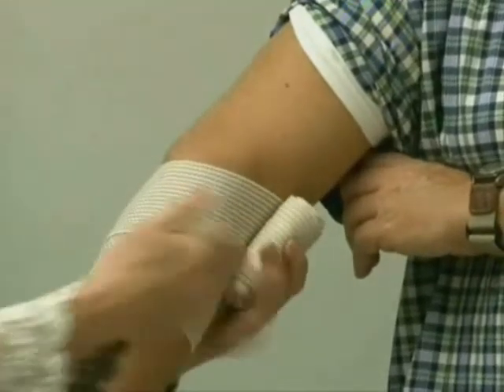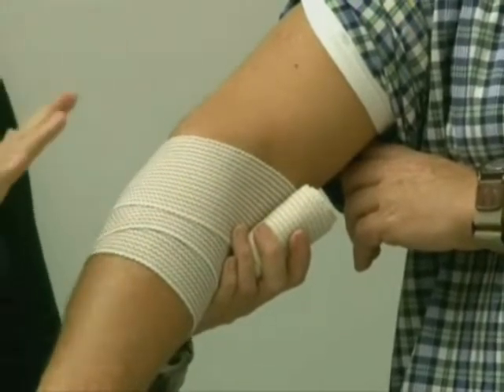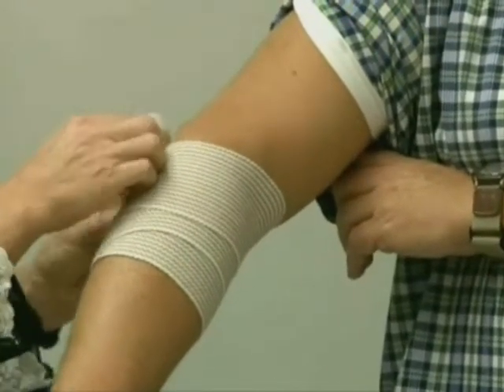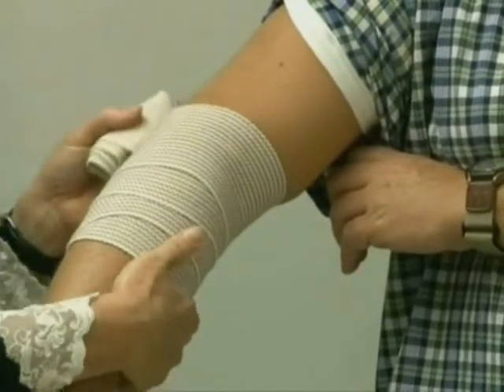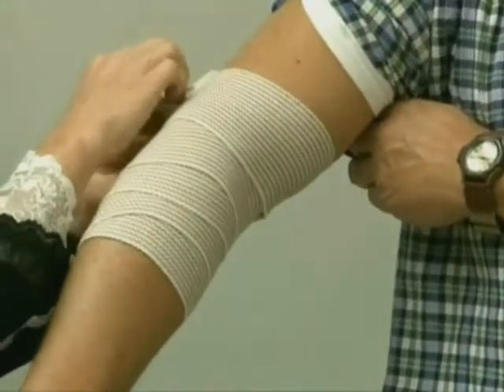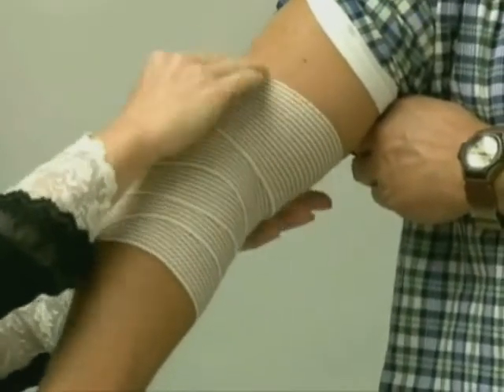So I'm going across — and it would really be helpful if he could sit down and lay it on a table. If it's injured it's really going to be hurting right now, or if I had an assistant to help hold. We're overlapping by about a half, going across the injured joint. Try not to move his arm because it does hurt. And we're going to end with the Velcro right there.